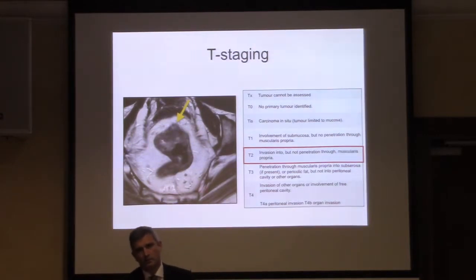The only caution I would give you is that tumours can necrose. So the centre of the tumour might depress and have an ulcer in it. So the thickest bits might not be in the centre anymore. But that's where it should be thickest before it rotted down. So those are the margins.